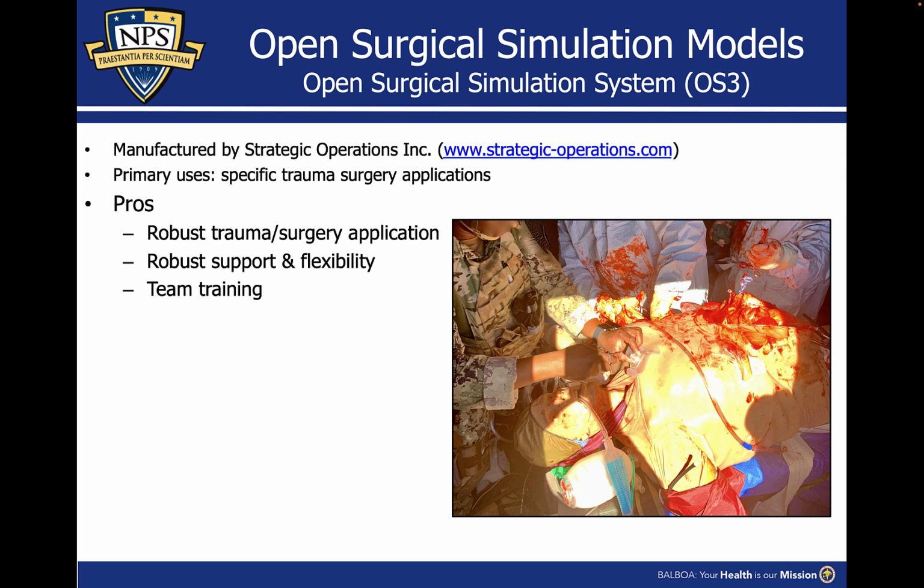These models, as well as the cut suit, are fantastic for team training, not just the individual tasks associated with the surgeries, but also dealing with the communication between the anesthesiologist, between the surgical tech, between medics bringing these folks in, as well as transitions of care, as these models are able to be moved in between different transitions.